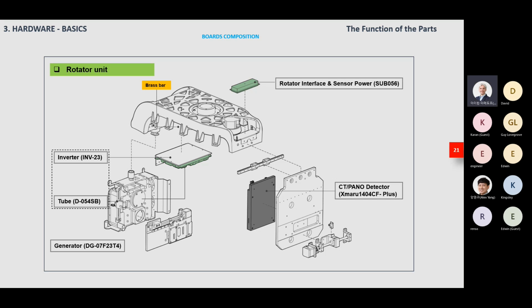When the tube, the collimator, and the sensor are on the rotator and it is moving, they also move simultaneously. In order to move the sensor to match the collimator, this motor is required. So how does that happen? Mr. Alex will explain it to you in tomorrow's section. This is just for hardware understanding.